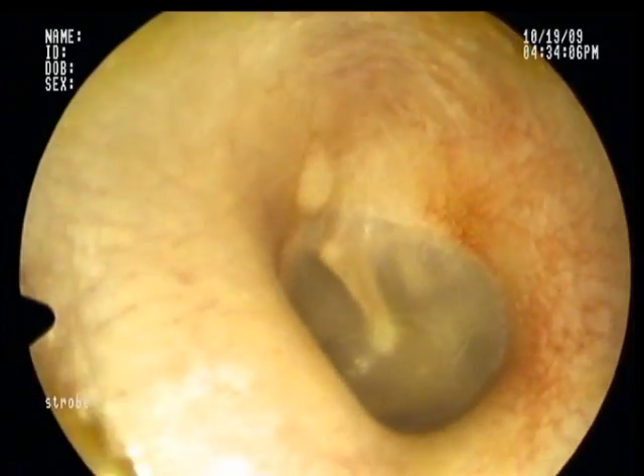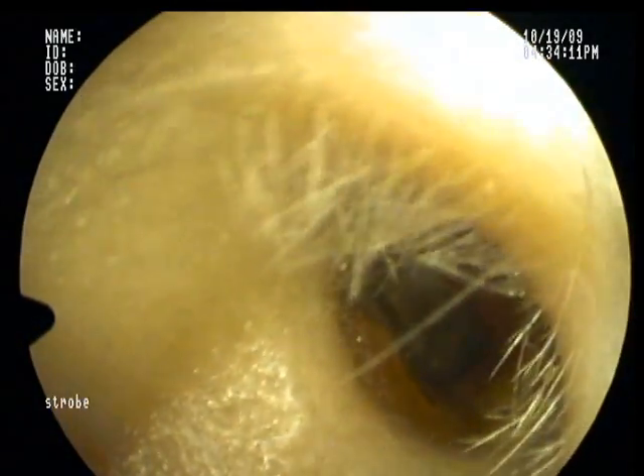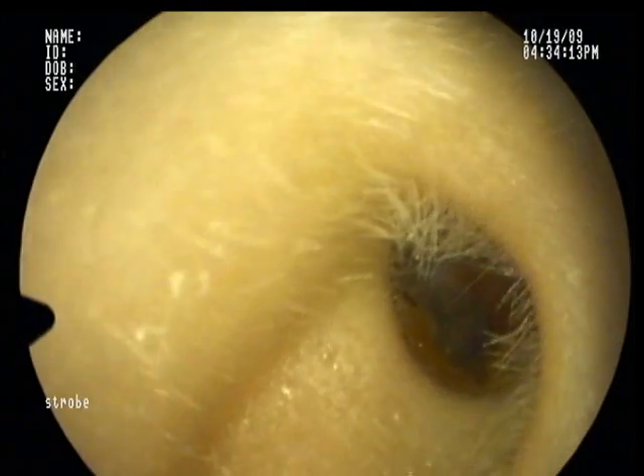As I exit my ear canal, you can see a little bit of normal, old wax. Some ear hair, which is relatively normal. As we come out, you can see the remainder of the front part of my ear, leading to my eye.